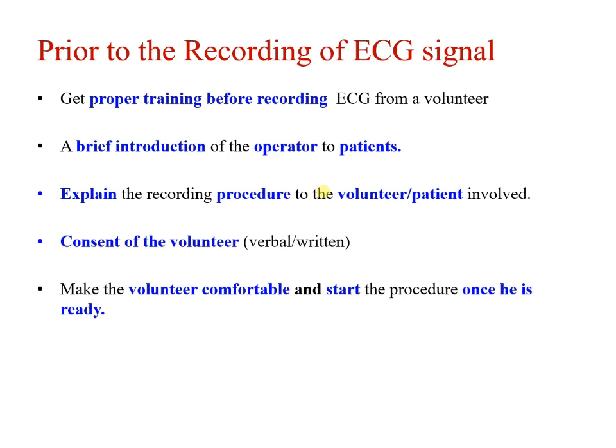And start the recording when your patient is comfortable and relaxed. Wait for some time to get your volunteer comfortable, and then you can start your procedure once he or she is completely ready.